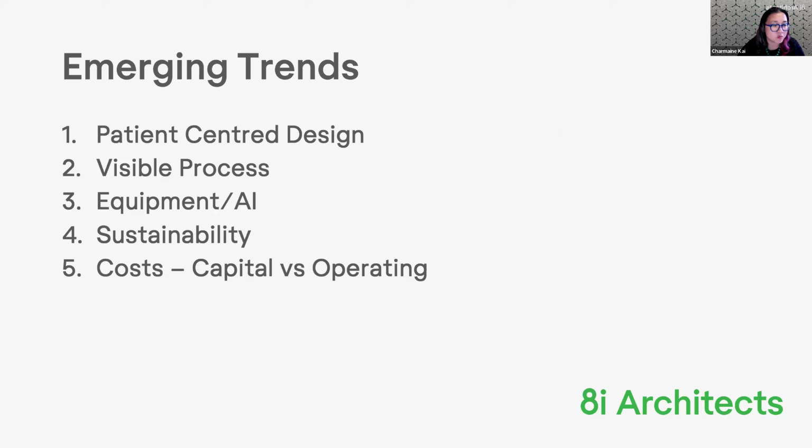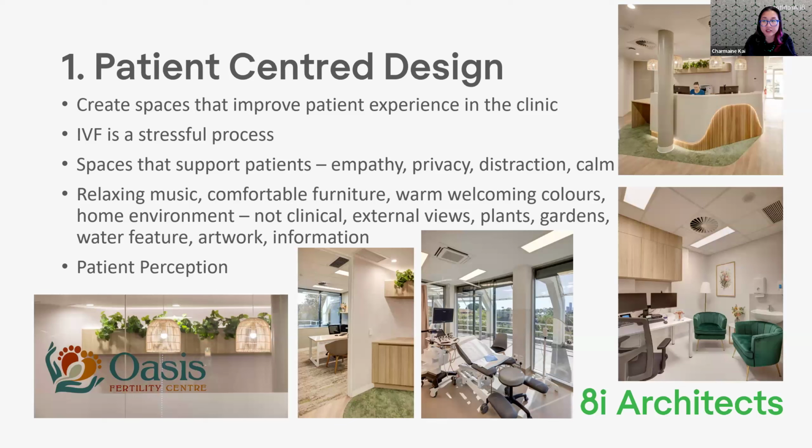So a few emerging trends. Patient-centered design, which has been around for a while, but it's really ramping up at the moment. A visible process for the patients, equipment, AI, sustainability, and costs. So I'll just go into the patient-centered design.